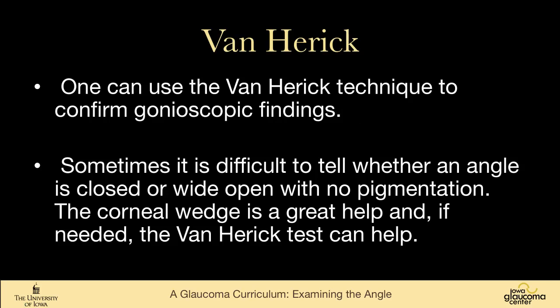So the Spaeth system is a great system. It's a little bit more complex to learn, but it's something that I think is really helpful to use.